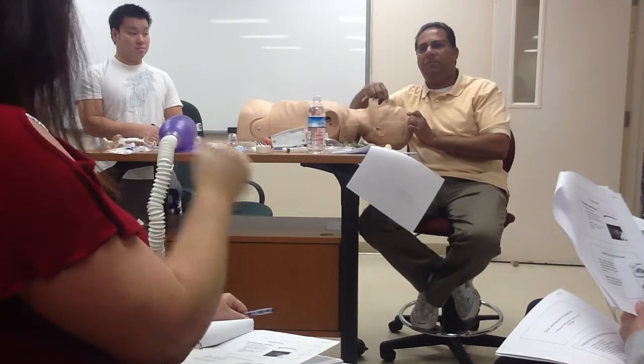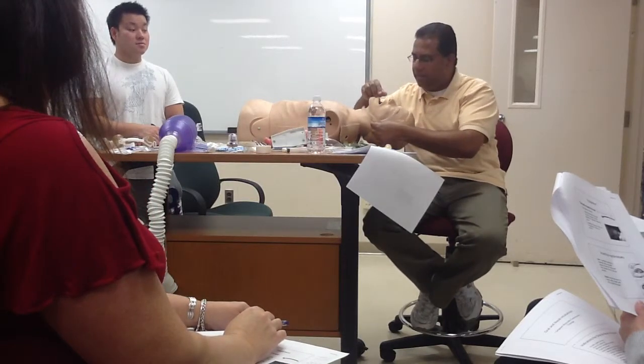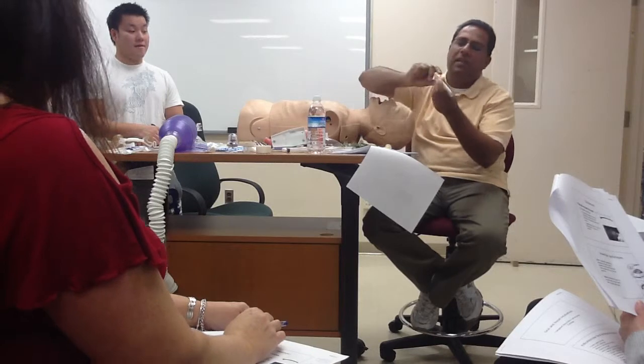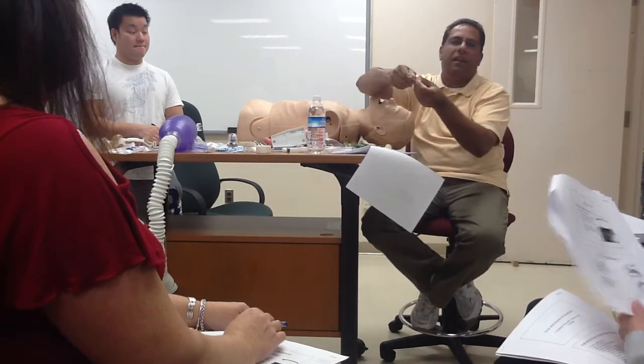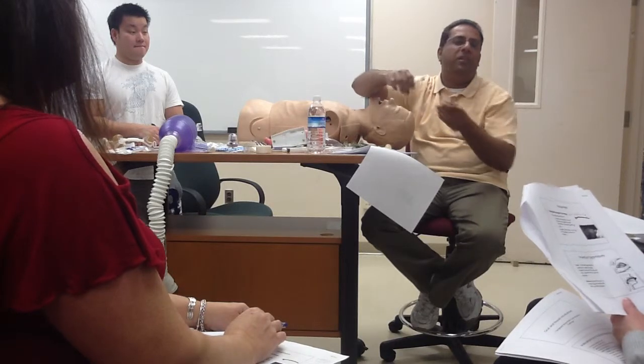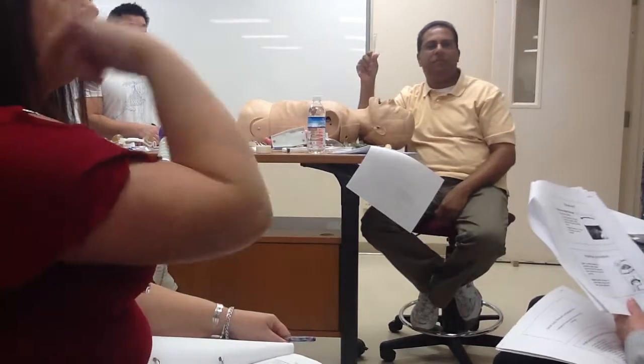Okay, so put that big one in. The center is the middle. John is right. Outside the box, the sizing is John is right. But the diameter, look at this. Yeah, look at that. So you would go a little bigger? Yeah, I mean, if you really want to suction the patient, you always want to err on being slightly bigger.